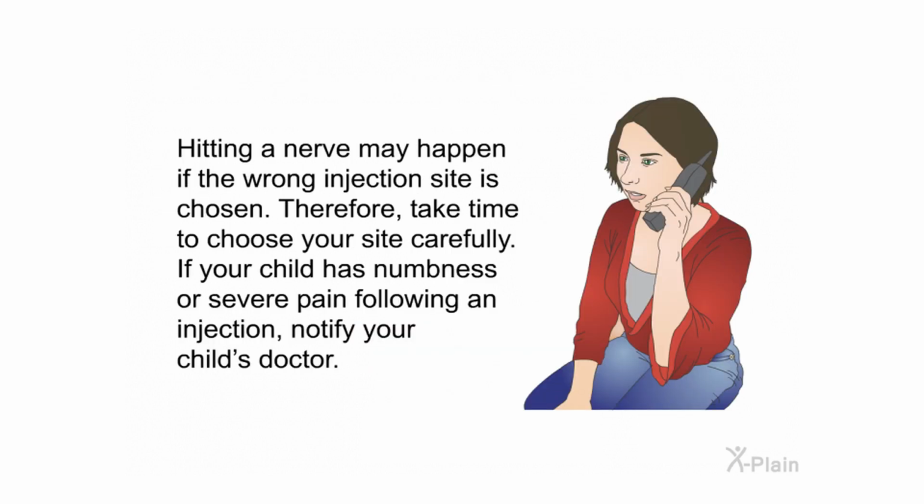Hitting a nerve may happen if the wrong injection site is chosen. Therefore, take time to choose your site carefully. If your child has numbness or severe pain following an injection, notify your child's doctor.